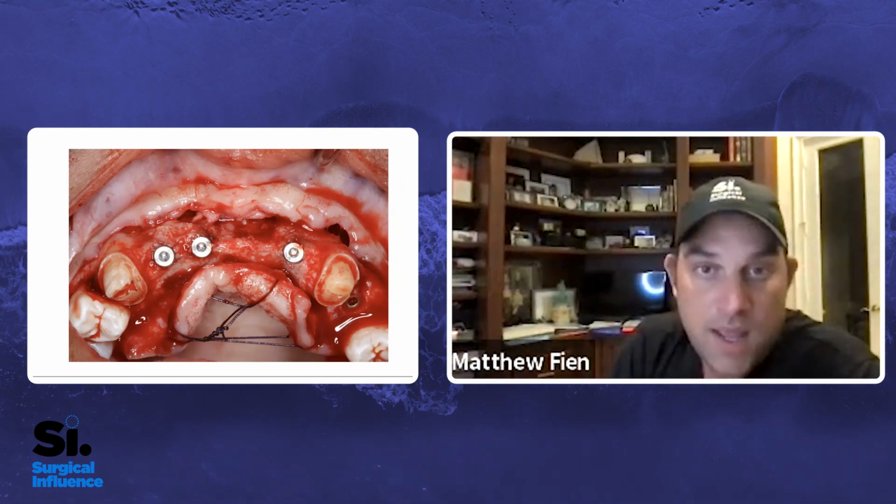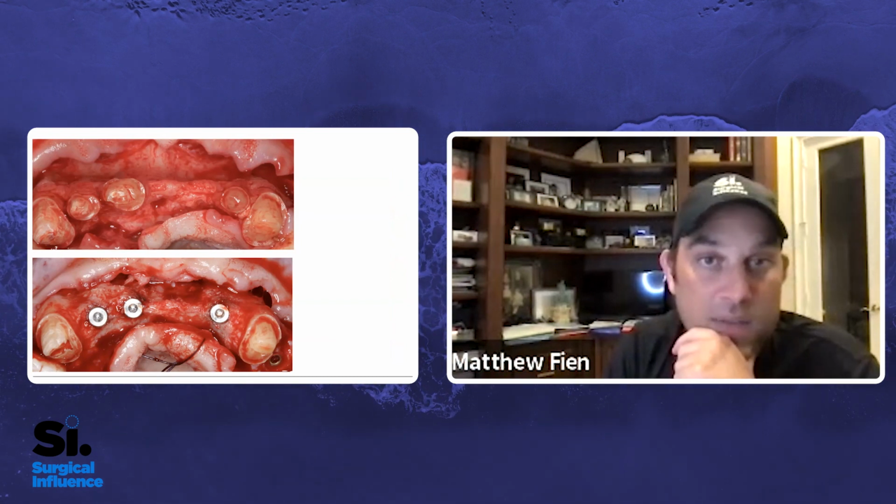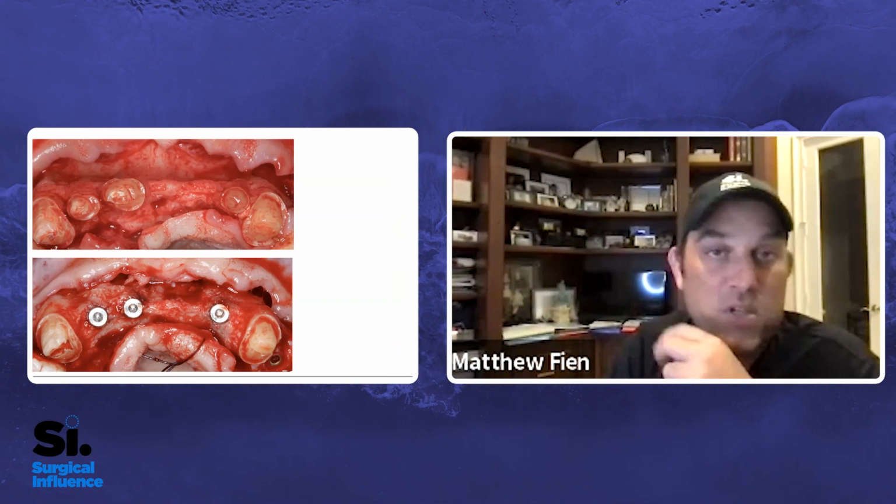I took a photo. And if you look back and compare, okay, I did okay at some of the sites. I mean, I did fill in some of that concavity, but these are the cases that haunt me. Like, why did this case not regenerate where most of them do? And I really think it comes down to not only the patient's own skeletal envelope, but also the lip pressure.